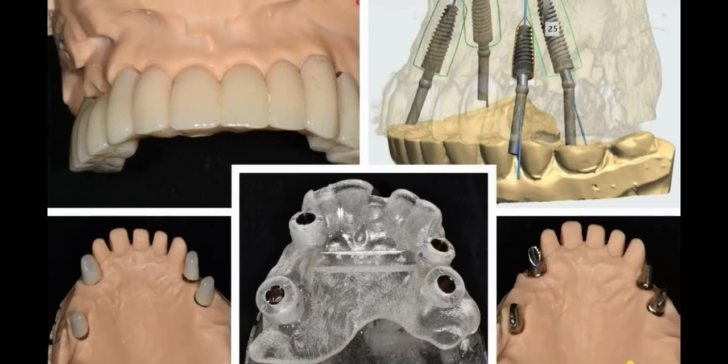The use of computer-guided planning enabled the preparation of all the components prior to surgery, resulting in a swift and accurate surgical procedure and simplifying the completion of the temporary bridge. The considerable saving in chairside time far outweighed the preparation of the planning stage.